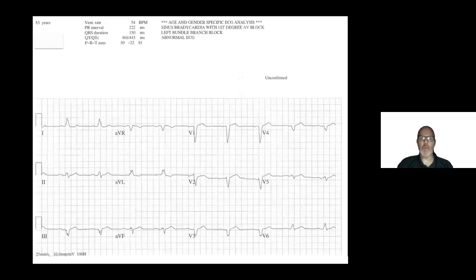Yet another left bundle branch block. The QRS, fairly wide, 150 milliseconds. But if I look down here in lead two, I see very clear P waves. I see P waves in multiple leads. So there's no doubt in your mind that the underlying rhythm is sinus. The QRS is wide. So now we're going to look at lead V1 to help us out. Put a horizontal line to the left of the J point. First complete triangle you make is pointed down. In this case, the only triangle you make is pointed down. And then you have these monomorphic R waves out in leads one, AVL, and V6.